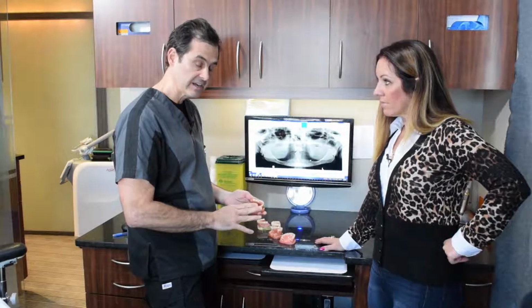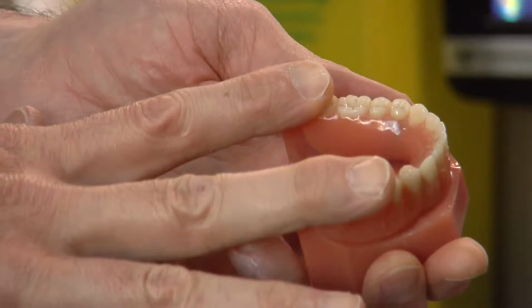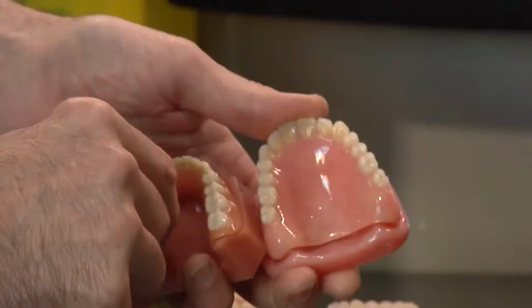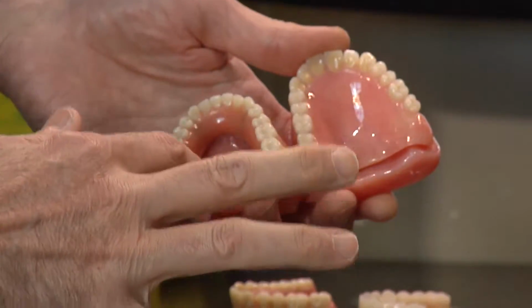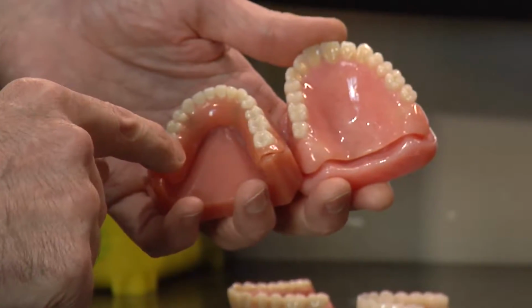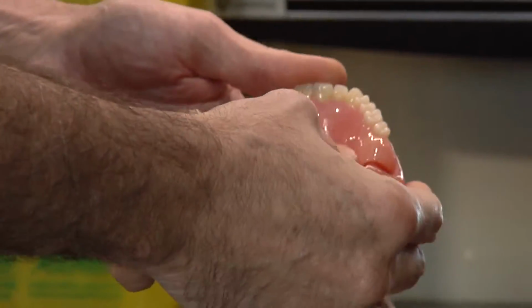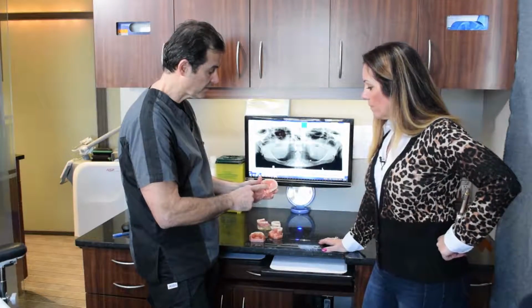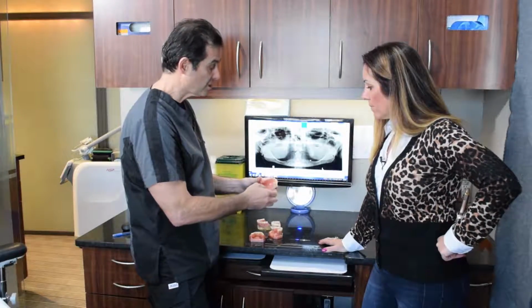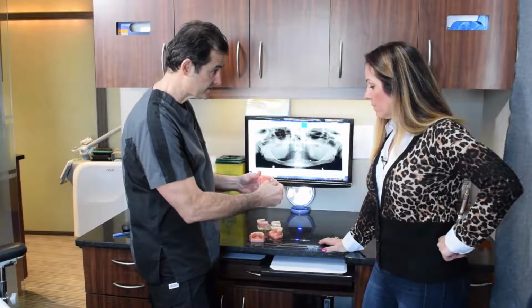And typically the one that is the loosest is generally the bottom denture. You can see if you compare these two dentures that the bottom one doesn't have the surface area. This is all open. The tongue is sitting in here. So it's a horseshoe. Whereas the top one has all of this surface area here. So some of the factors that go into success or failure of being able to wear one of these is what kind of jaw bone have you got left? Is there enough volume to hold this in?